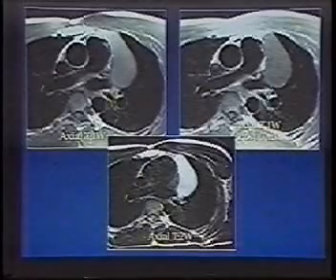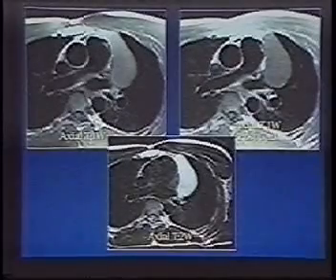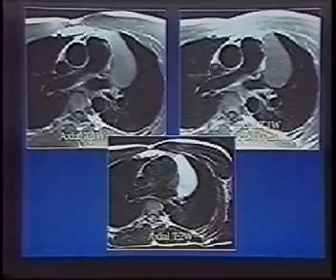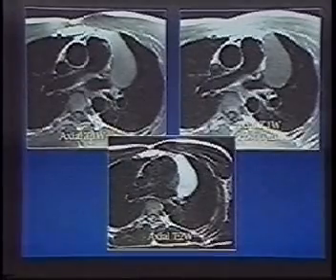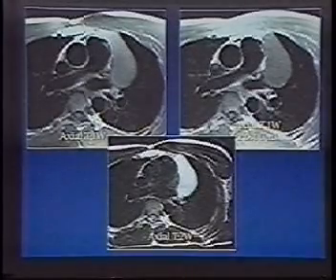Well, you know, my father is a cardiologist, and I hold cardiologists in high regard, but I do have to say that once they grab hold of a patient, they don't let them go unless they have to. And rather than getting other imaging on this patient, like a CT, what they did was an echocardiogram. And echocardiography was done because they thought, could this be a vascular mass? But that's probably not the best thing to do when you get a mediastinal mass.